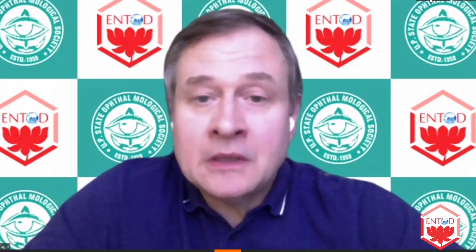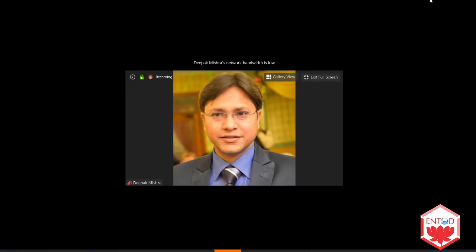Yeah, actually, it's a big difference, because if you do it after the rexis, you can easily catch the capsulorhexis edge, which happens in many cases, although you can make some precautionary maneuvers, such as injecting viscoelastic behind the iris to separate it from the anterior capsule, which I always do when I inject the ring after capsulorhexis. However, it is not a guarantee that you will not catch the rhexis edge.